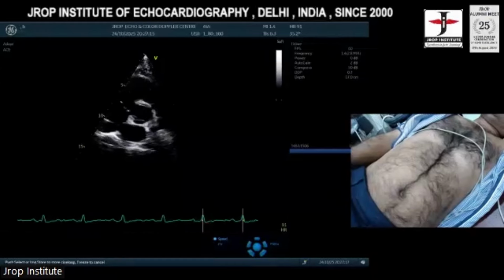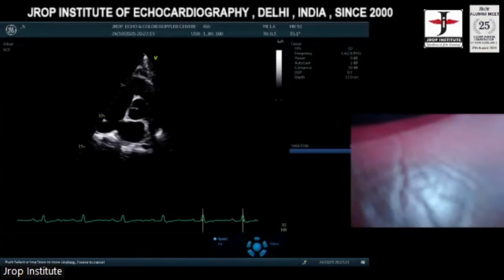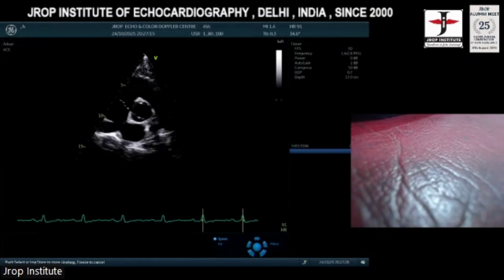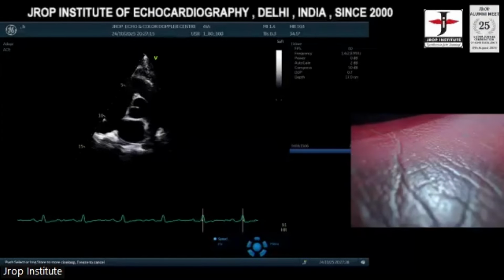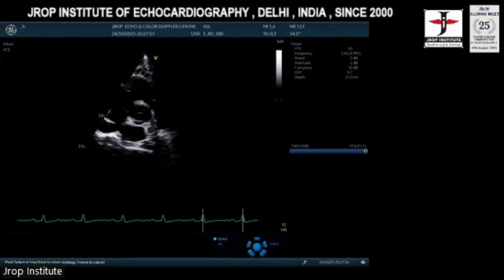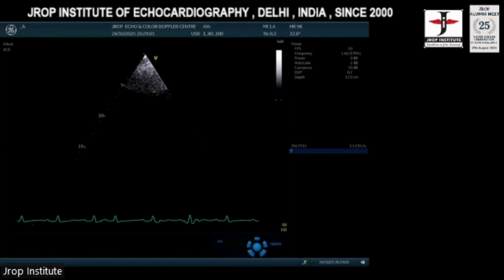Okay, sir. See the picture? Turn on the other side.